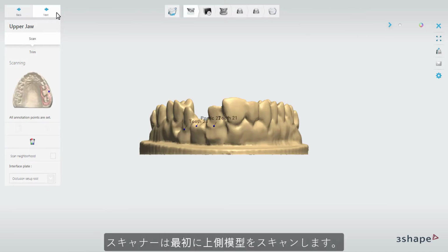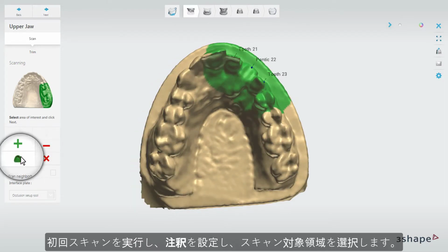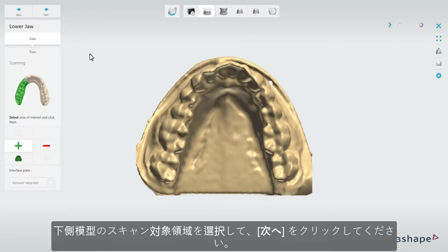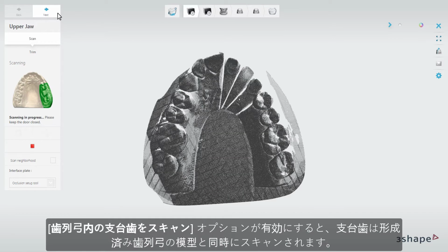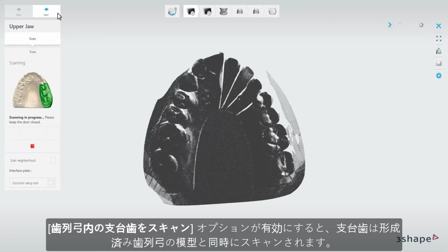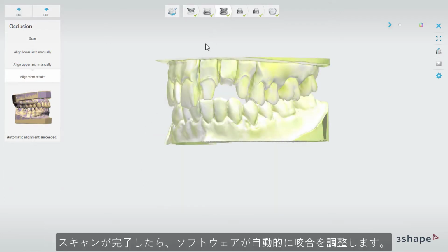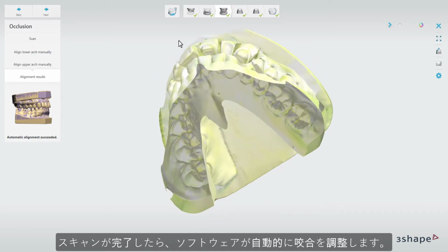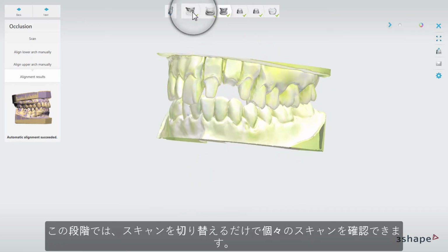The scanner will first scan the upper model. On the initial scan, set the annotation and select the scan area. Then select the scan area for the lower model and click Next. The die will be scanned at the same time if the Scan Die in Arch option is enabled. Then the lower model will be scanned. When scanning has finished, the software automatically aligns bite thanks to the earlier calibration of interface plates. At that stage, you can also check on individual scans just by switching between them.